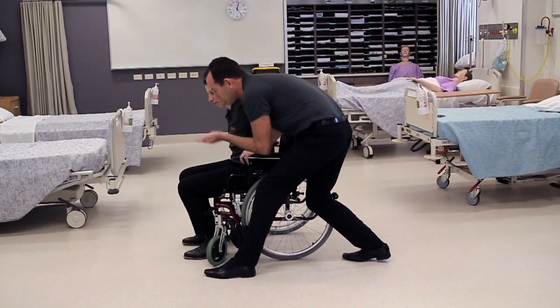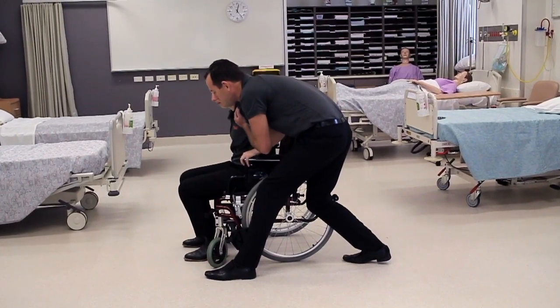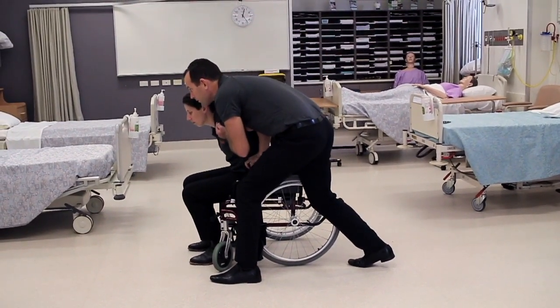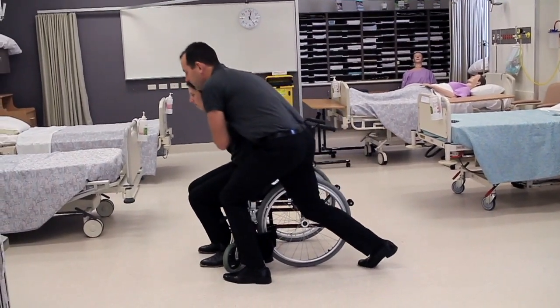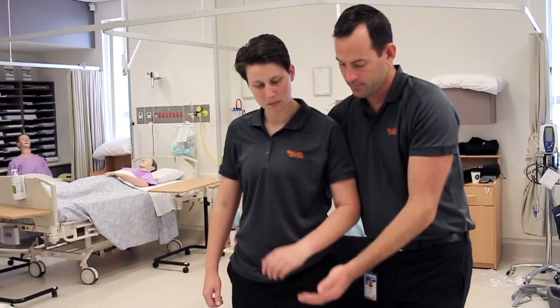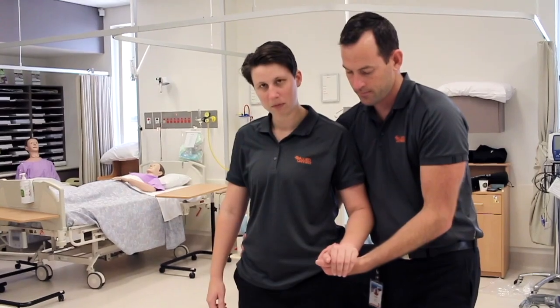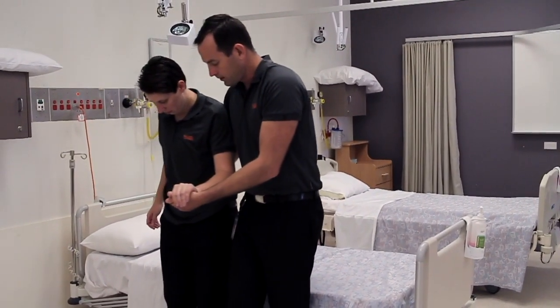Give nice clear cues such as forwards, backwards, and stand. Using weight shift and applying force to assist the consumer to stand. Once they're standing nice and tall, we can assist them by allowing them to hold the carer's hand for directional guidance only.